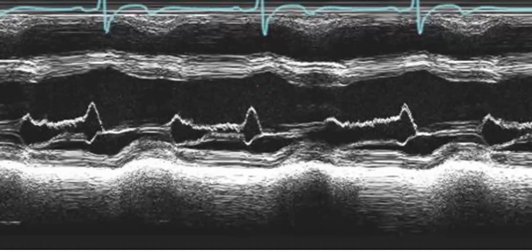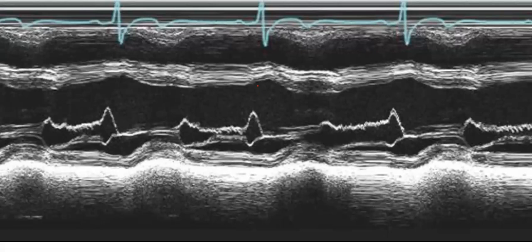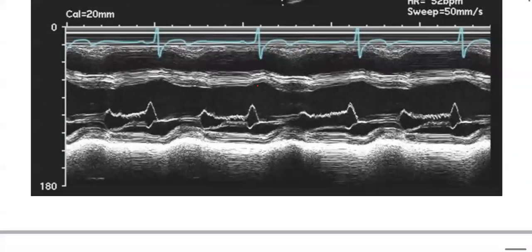And this is seen clinically as Austin Flint murmur, which is akin to the mid-diastolic rumbling murmur of mitral stenosis, because this is functional mitral stenosis. Functional because the mitral valve is normal, but is constricted from outside by the jet, so it doesn't open well. So it's functionally obstructed, and you could appreciate the Austin Flint murmur, which is similar to the mid-diastolic rumbling murmur of mitral stenosis, okay? So remember this one, the flutter and the limited opening are different.